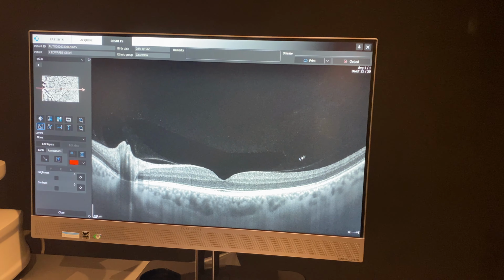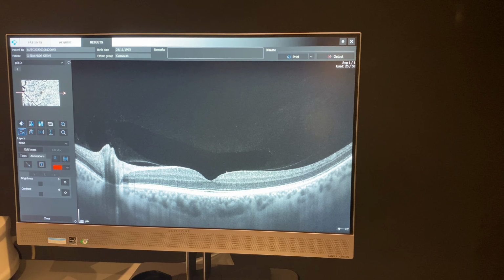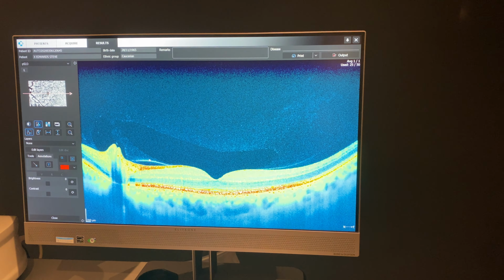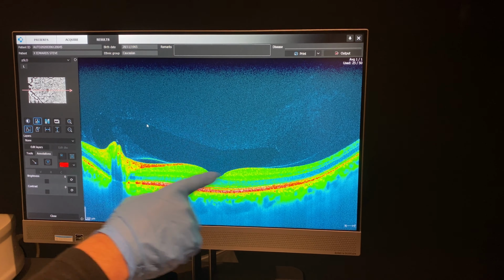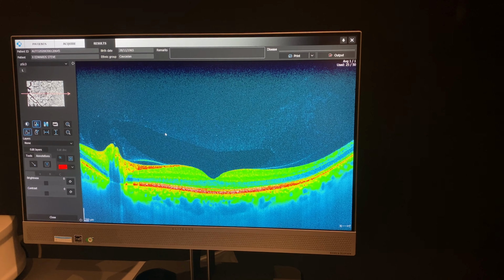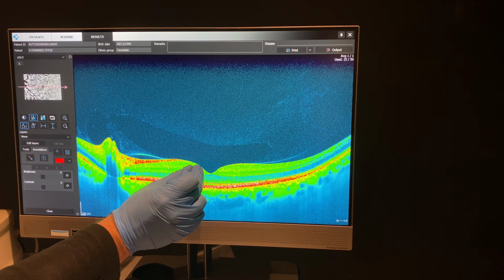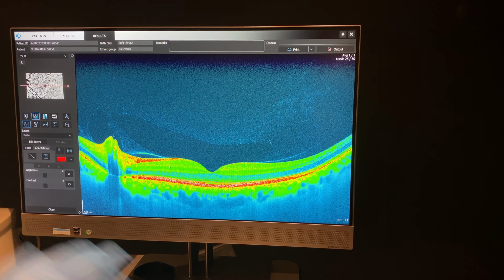So now if I blow this one up, normally with OCT scans you're always looking at black and white because you'd get noise interference, but because we asked it for a very quick image, we can actually look at it in colour and you can see the detail. I mean, obviously that's still the vitreous, but it's a different density. It looks like a pocket. I think it's the premacular bursa, but I stand to be corrected on that. But yeah, you can see my vitreous nicely attached, because obviously when it gets closer and closer, what you're doing for my benefit is when it does lift away, it doesn't start pulling any layers with it.